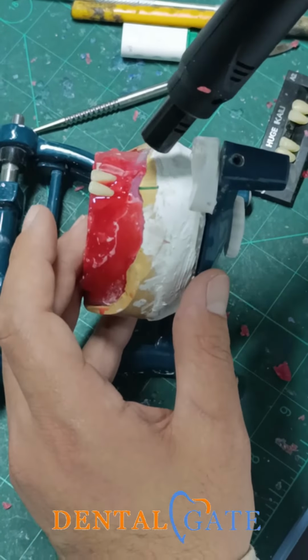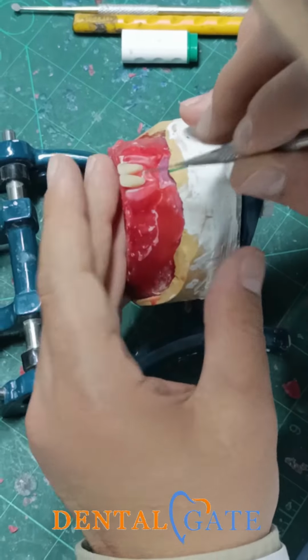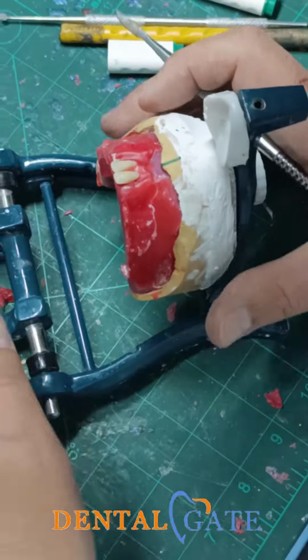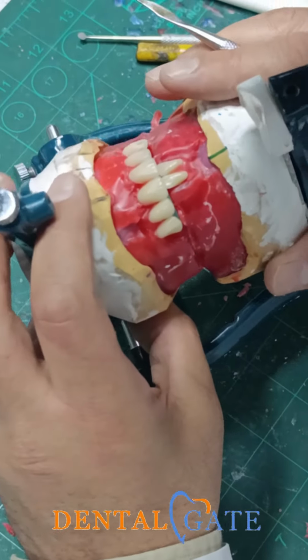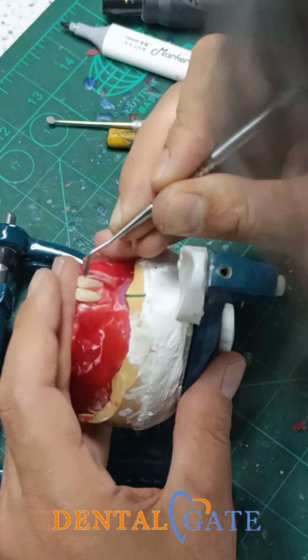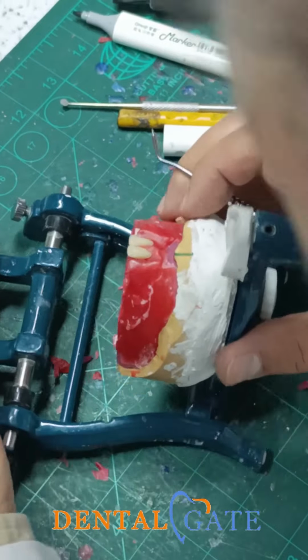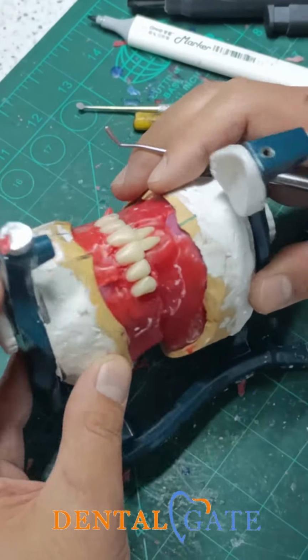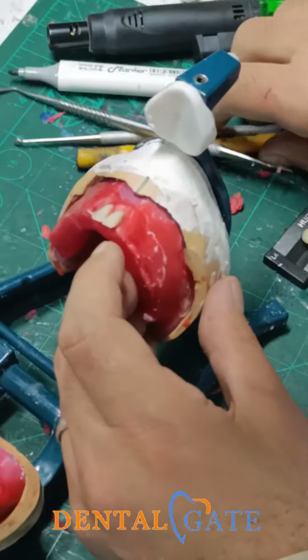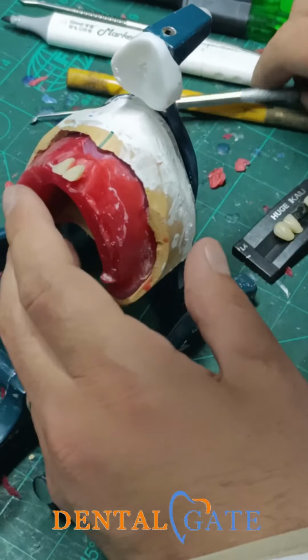So now make a melting here, and regarding the central, you have a reference here. Put it in the same position now and make an initial check of the central incisor. I think we have a defect here. It is pushed to the lingual. We still have a mistake here. Make a double check to see why we had a mistake, because it's out of the ridge. Now you can see we have wax here. We will remove it to have freedom in the movement of the tooth.